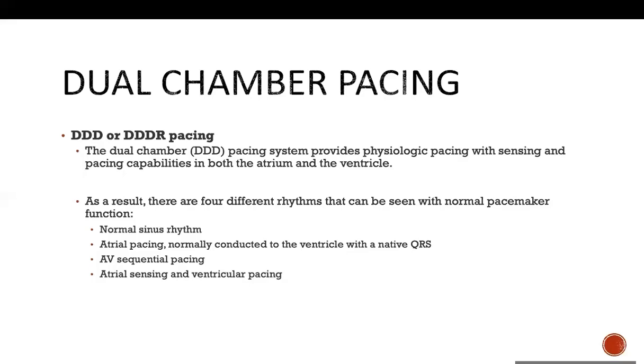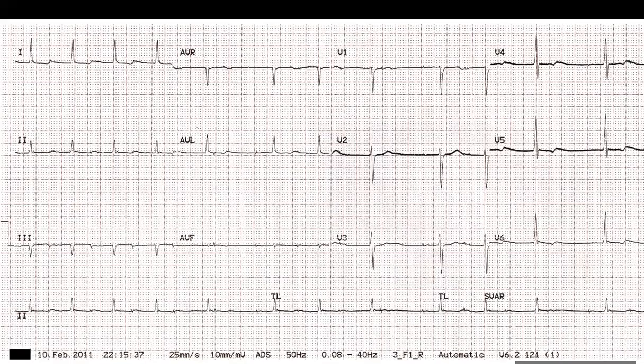Doctor, I have a question. Go ahead. That means if we had a long strip, we would see the same picture repeated every time, the dropped beat? That's why I would think yes, this is most likely an atrial pacemaker.